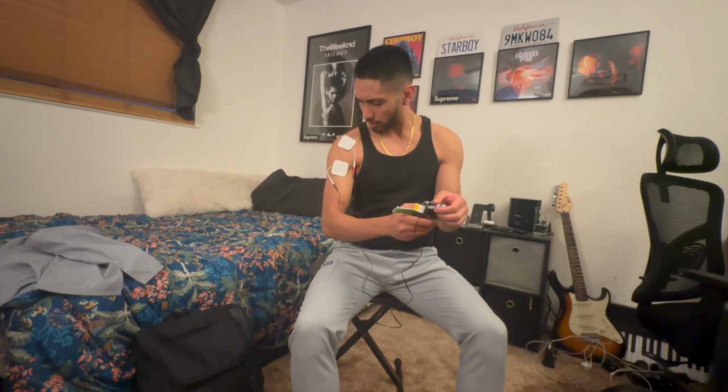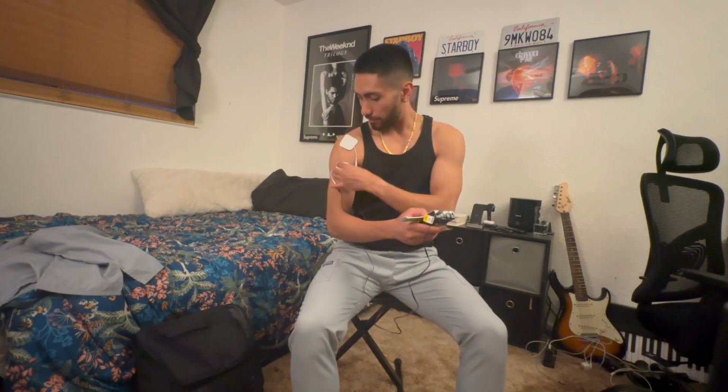And then with burst, I'll show you guys that too, what the effects are. We'll change my width to 150. And we'll be at 5 hertz. Let's change that intensity. It's almost similar to the acupuncture with twitch going on, but almost like a bit faster rate. But that is because my frequency is at 5, so let's reduce that down to 2. Now feeling that pretty much be like muscle contractions, muscle twitching going on. I'm doing nothing and it's just going at my arm. This is addressing endogenous opiate.